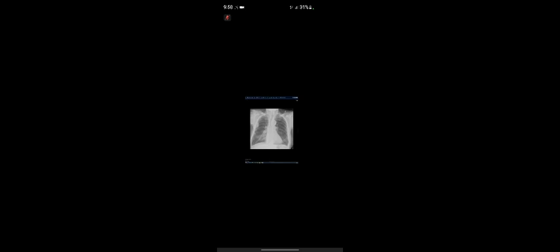but I would like to correlate to previous imaging, as I also know that there is one other differential for a benign pleural-based mass, such as a pleural fibroma. So if I can have a CT, it would allow me to better interrogate this lesion.